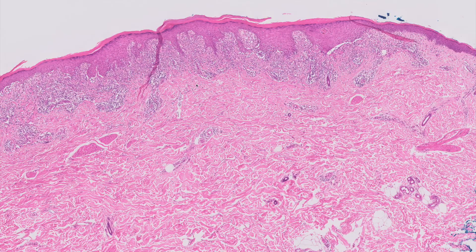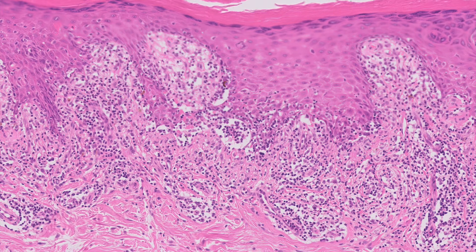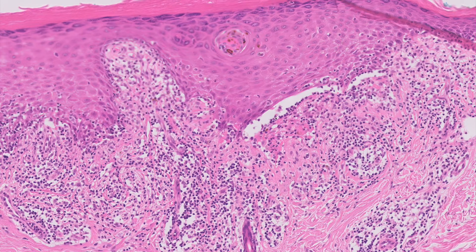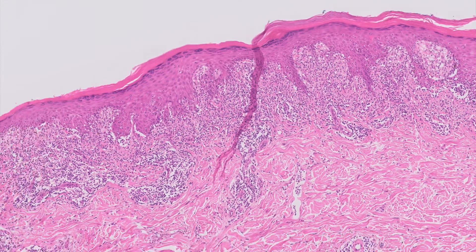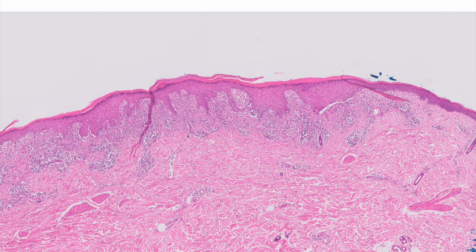Going in closer, we can see this very nice irregular sawtooth acanthosis of the epidermis with overlying hyperkeratosis and a quite brisk, band-like lymphohistiocytic inflammatory infiltrate. This is associated with quite extensive interface activity — basal cell damage, a shower cluster of apoptotic keratinocytes, and in some areas early separation of the epidermis from the underlying dermis, with a little area of clefting and early blistering.